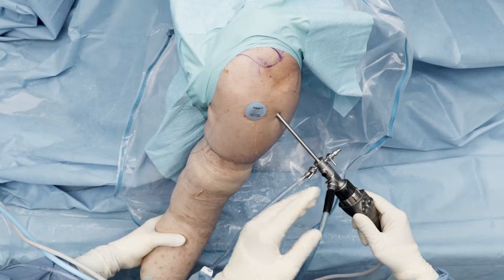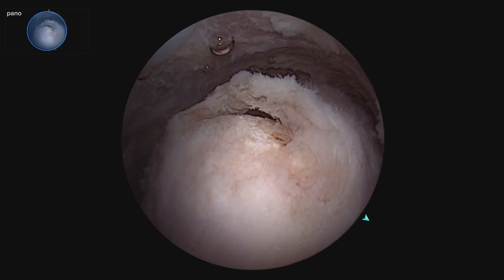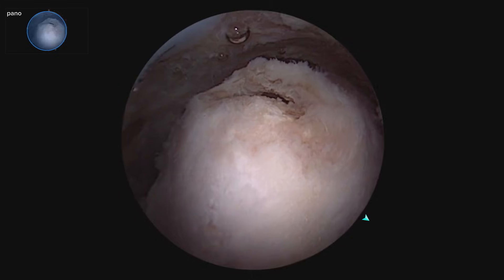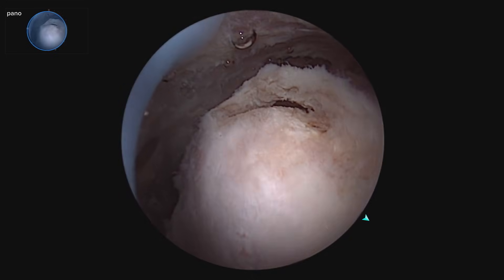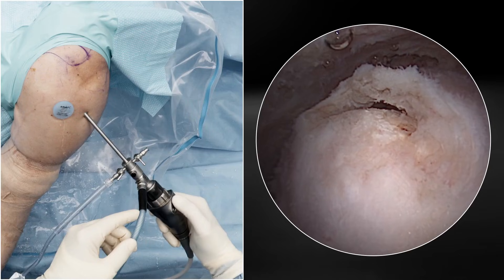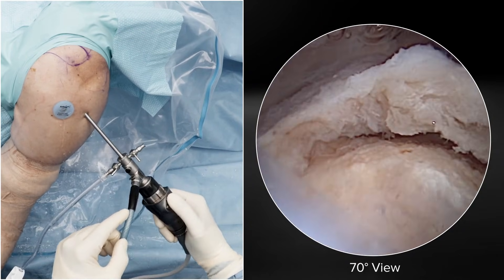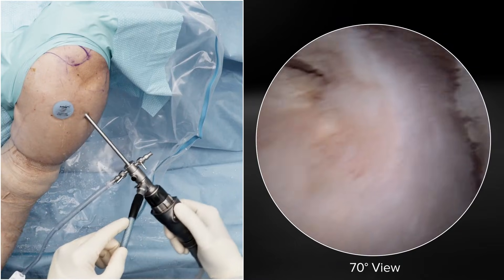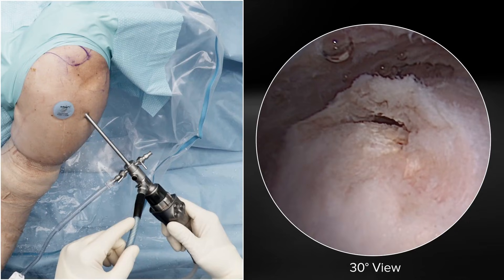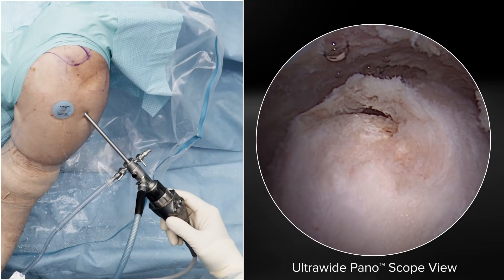We're utilizing the panoscope. We've got this ultra-wide panoscope view currently of the greater tuberosity and the small cuff tear. You can see the extent of the cuff tear and the entire greater tuberosity from front to back in this one view. With a press of a button we can cycle through a 70-degree view to look at it from the side, or a standard 30-degree view. Notice how the pano view gives us a much more global view of the greater tuberosity.